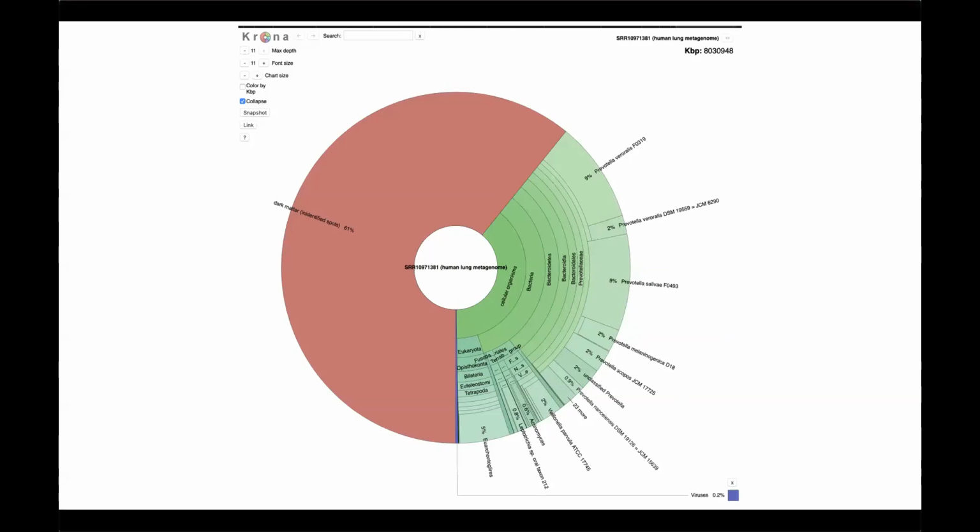So it's worth stopping here and thinking for a second that the way this discovery was done really is the brute force approach. You sequenced millions upon millions of reads, and then you ended up throwing away about 999 out of each 1,000 because they were not useful, they were not viral reads. But there was enough left over that you could not only identify there was a new virus, but produce an entire genome that wasn't actually too bad.